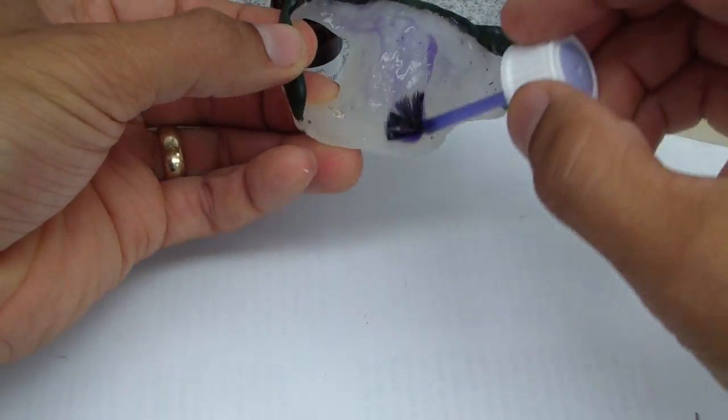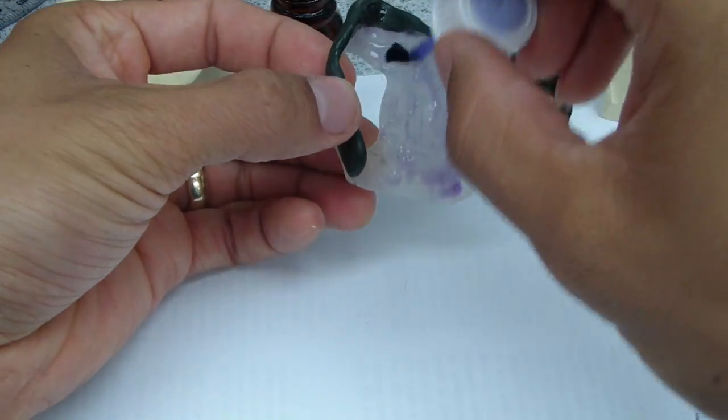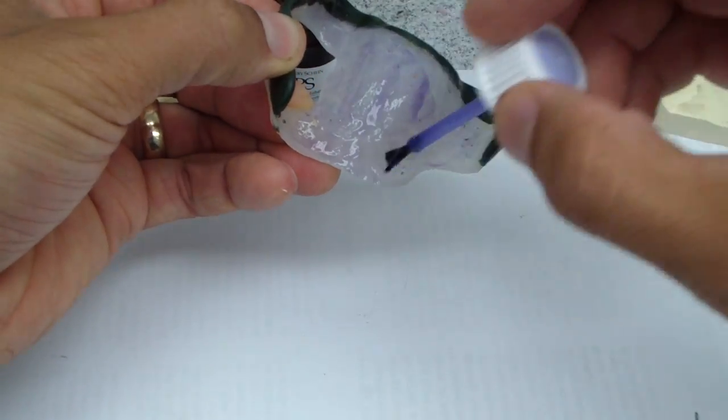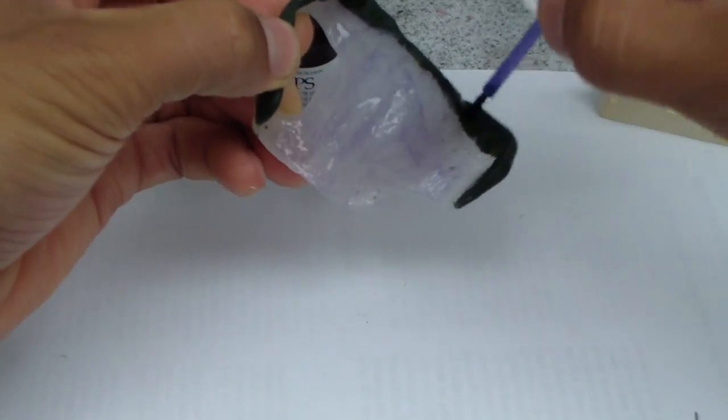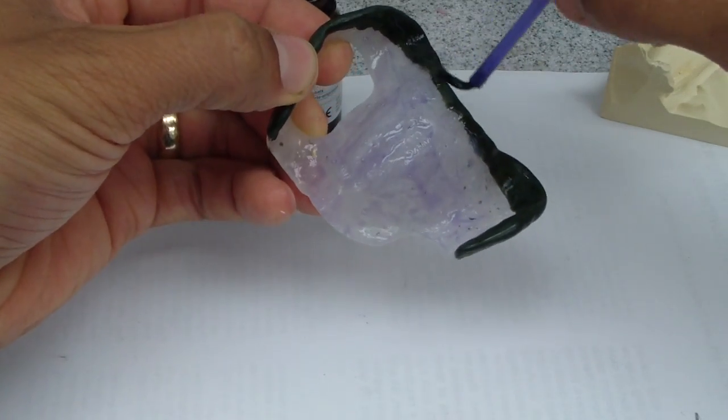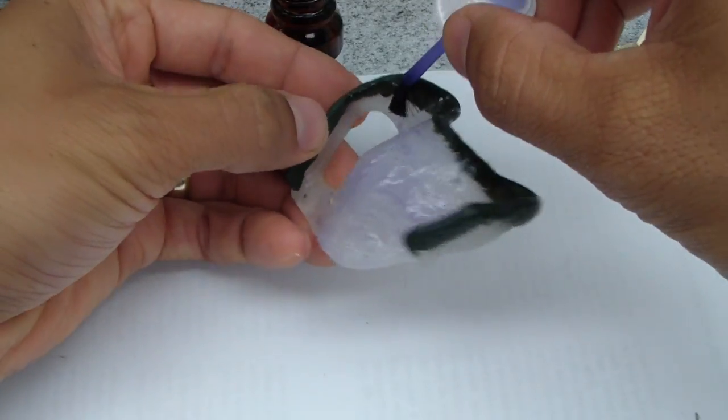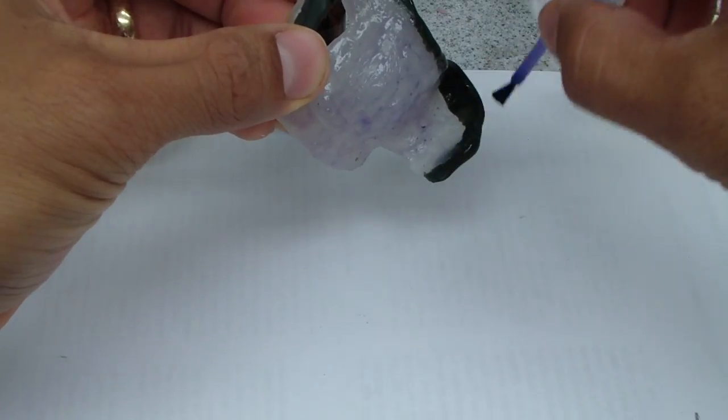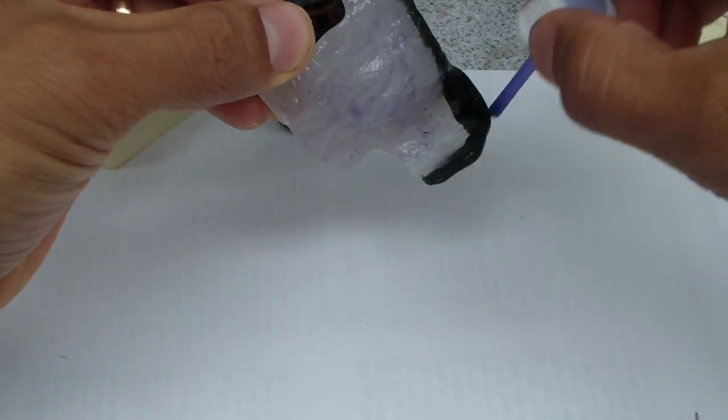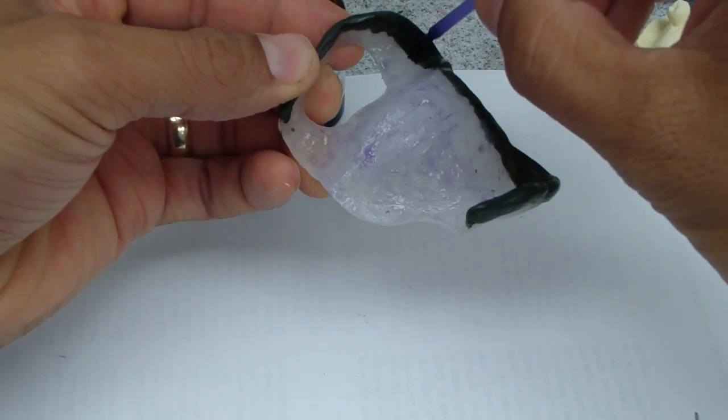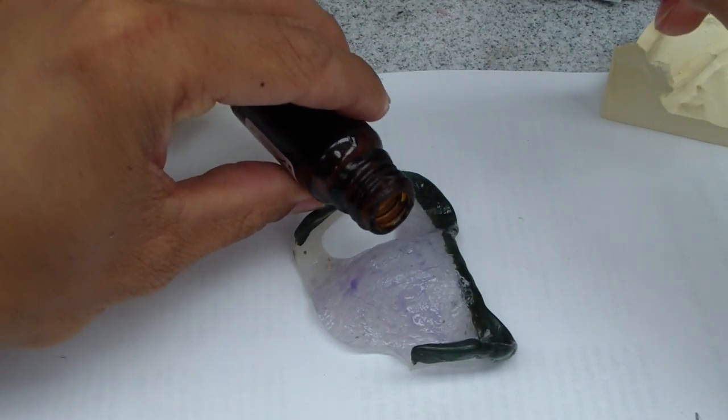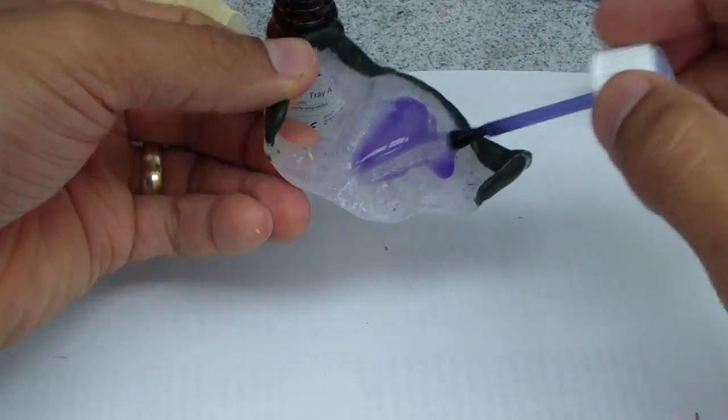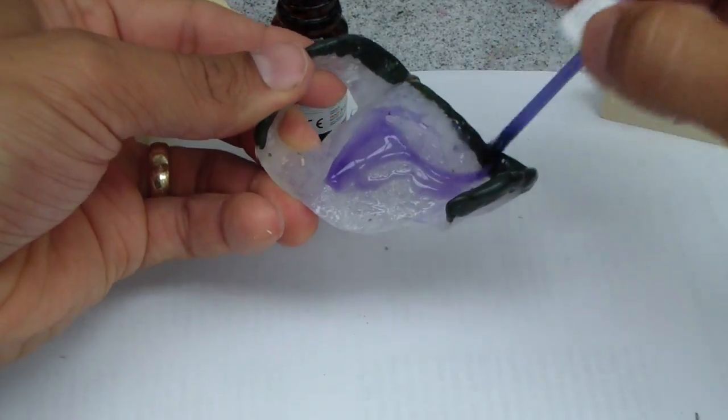And so what we're going to do is, the literature suggests that, and as Dr. Dre says, you got to let this dry for at least 6 to upwards to 10 minutes, because if it's not dry, this adhesive acts as a separator. So nothing's going to stick, it's actually going to be slippery. So we're just applying it in a fairly thin coat. And additionally, I'll be applying it along the border molding.